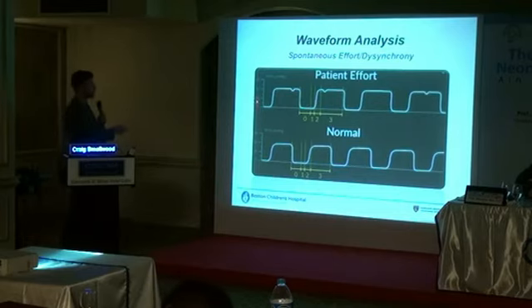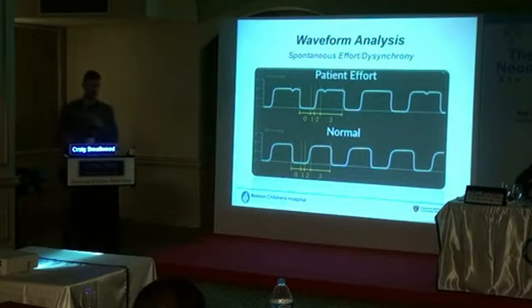You can see here that we inhale, we begin to exhale. Everything mostly looks okay except for these little dips. We see these periodic little decreases in CO2 during phase 3, which is usually the easiest portion of the capnograph to assess this. Basically, it's the patient taking a little bit of an inspiratory effort while the ventilator is trying to exhale. You can see there's a slight decrease in the CO2, and that's how it manifests.